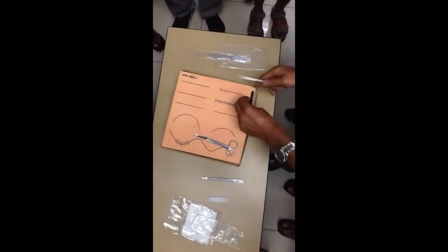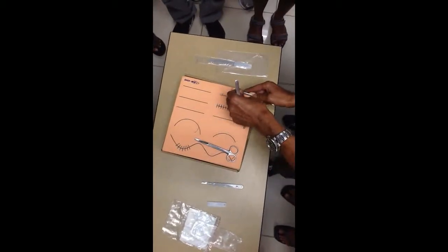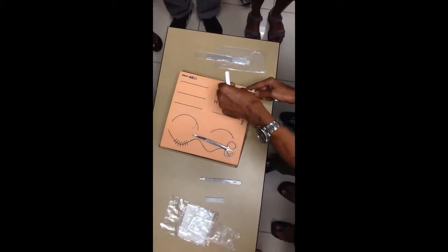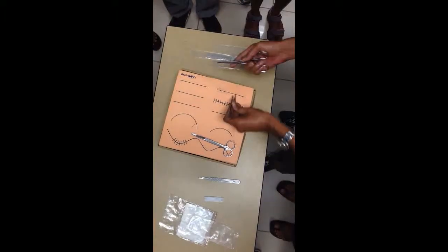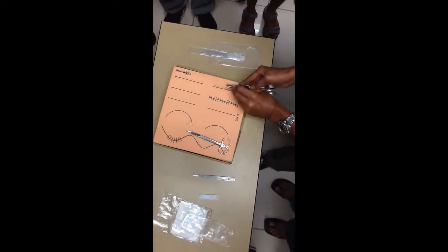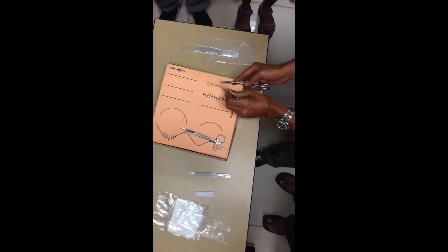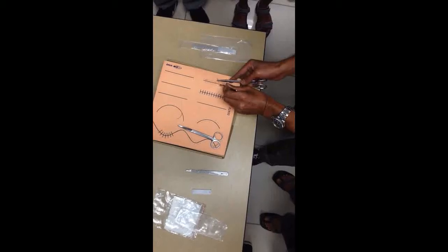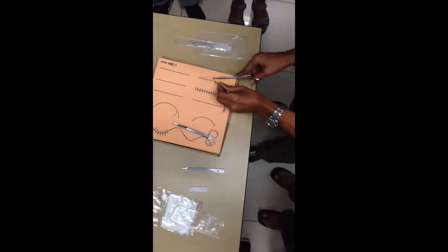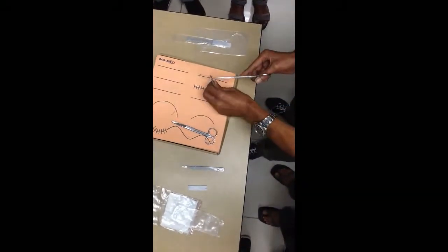The sutures should be almost evenly spaced out and roughly parallel with each other. When you reach the end, I'll show you how to finish the knot — that is a little tricky — so let me continue until we reach the end.